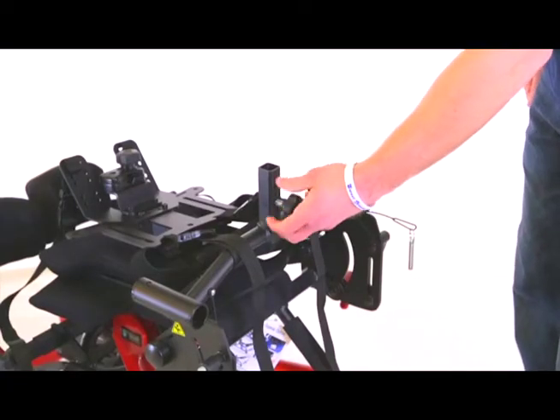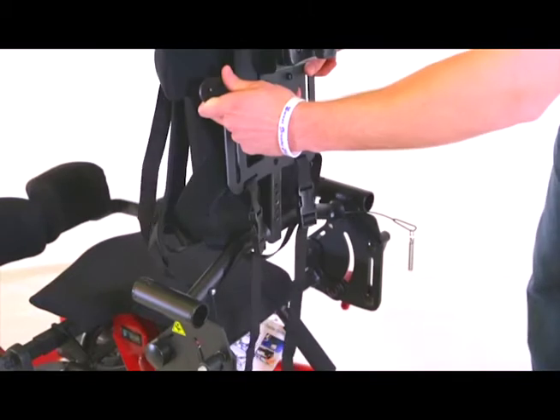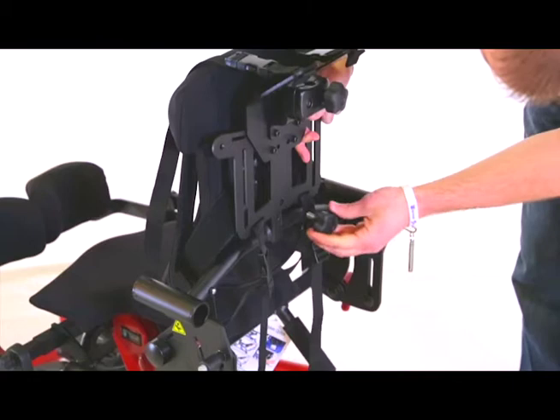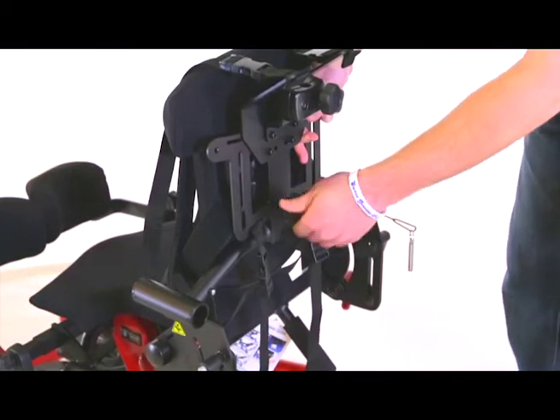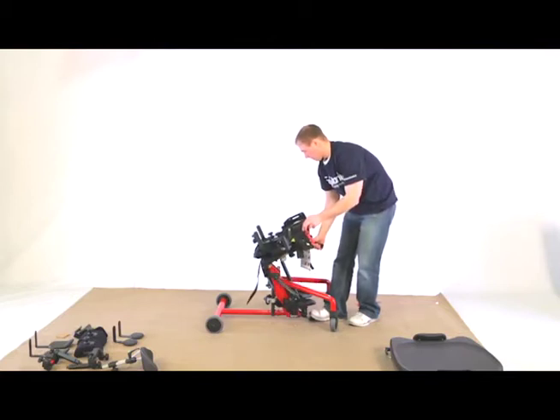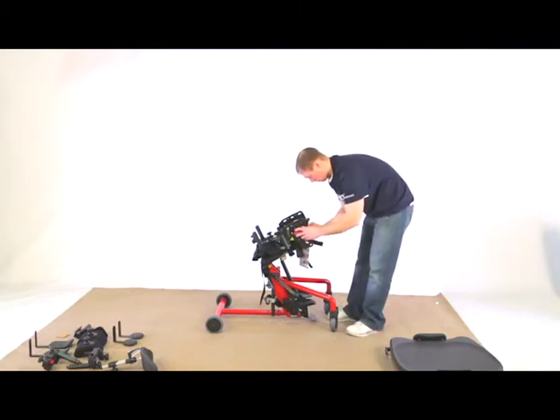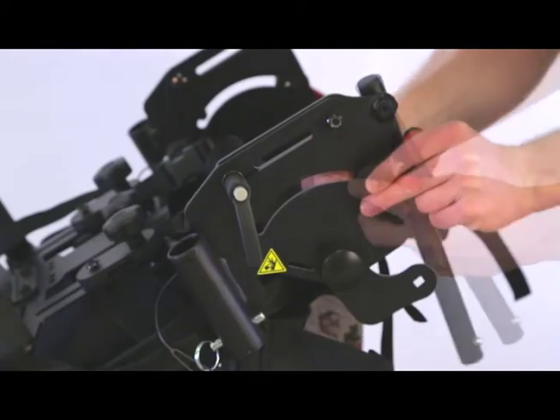If not already on the unit, remove the knob from the center post and place the back onto the unit as shown. Place the back in the desired position. Insert knob and tighten securely. Pump the unit up or step on the gas spring assist pedal to raise the seat about 3/4 the way up as shown.